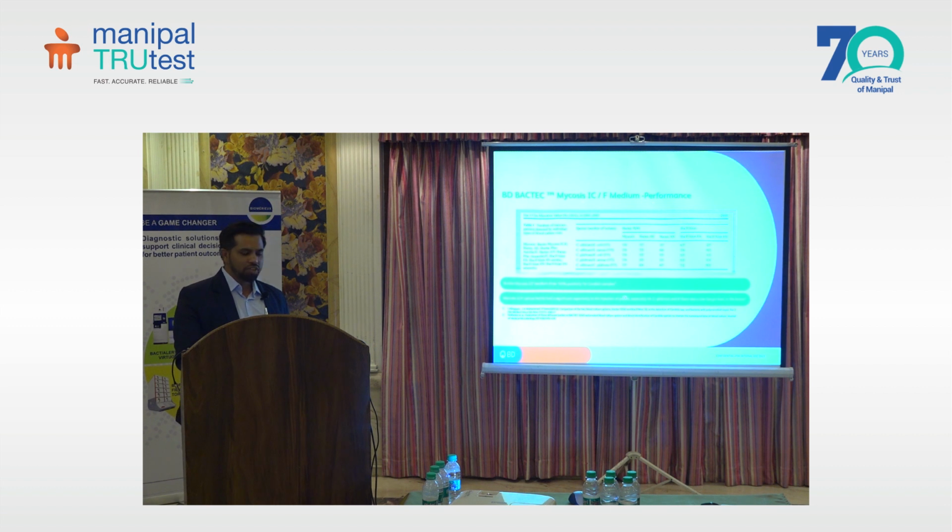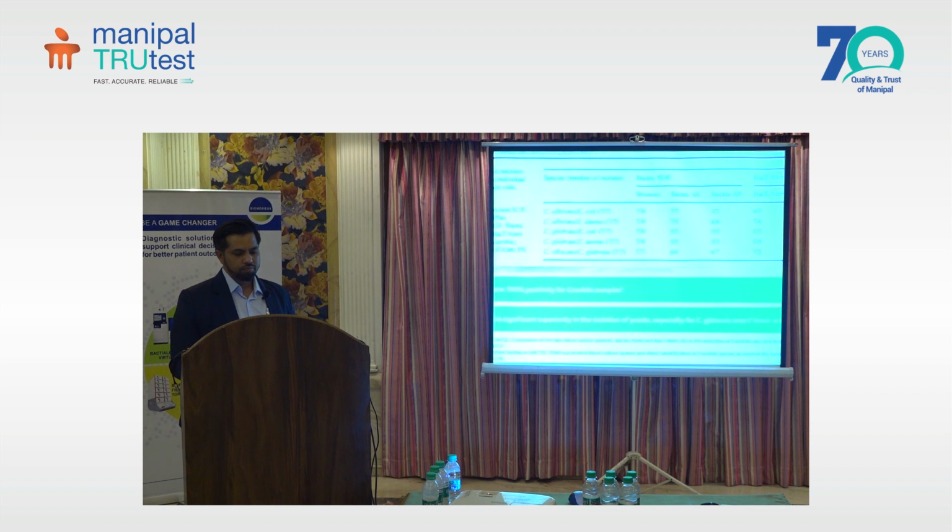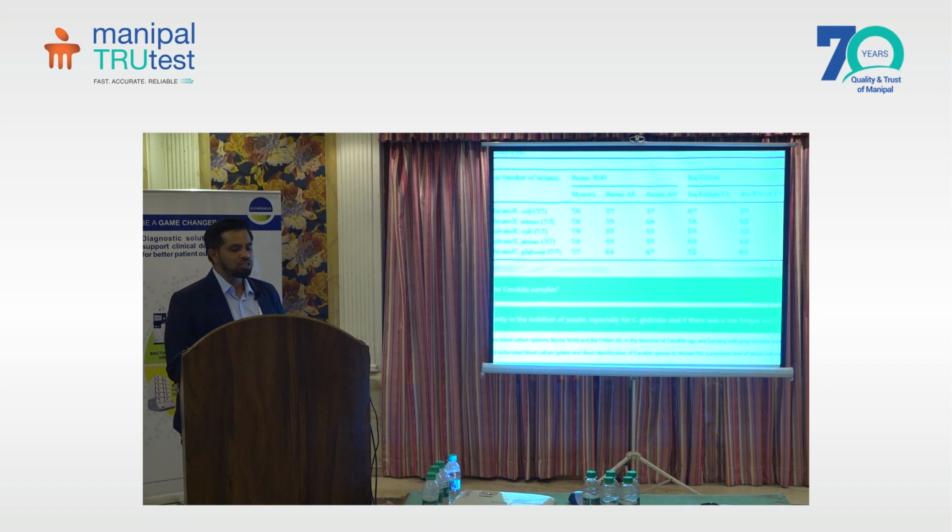This was the study which was done, and in this we can see almost 100% positivity for yeast, that is Candida samples. Here we can see 100% of Candida species were isolated in the Mycosis ICF media.